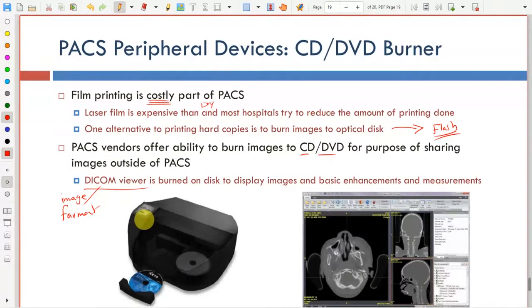Doctor, DICOM is a standard, right? Yes, but it's a standard for image formats. It's a digital image communication standard. Because you are saying it's a kind of format. Yes, it is a format, but it's a format that is governed by a standard. So it's a kind of program. It's an image format. You see images that are, for example, .dcm, like JPG on the computers. Yes, but it has a lot more features.